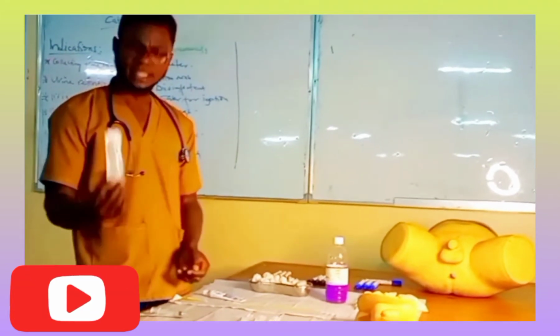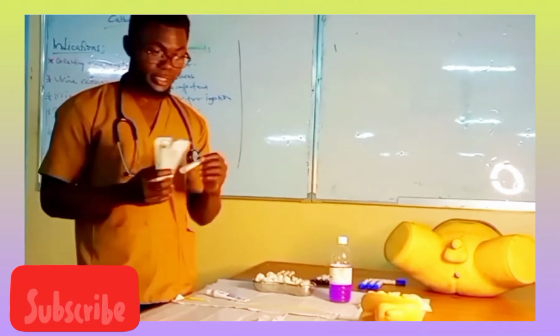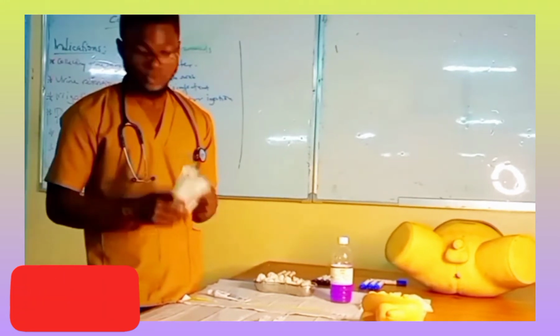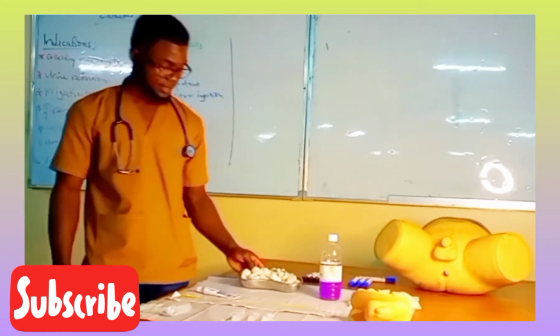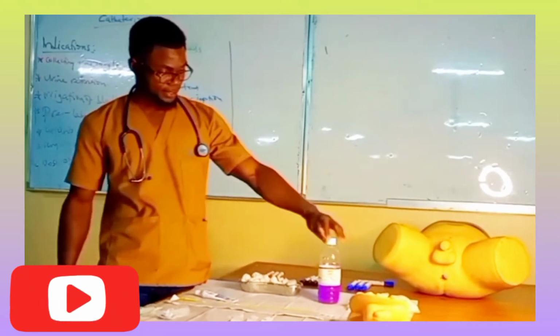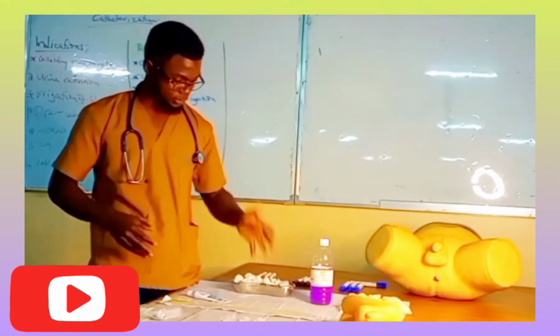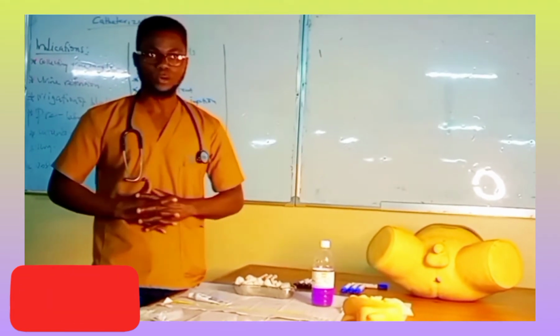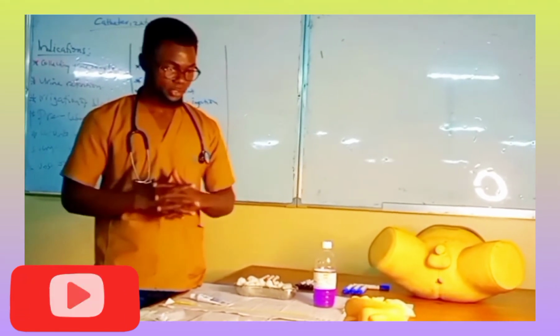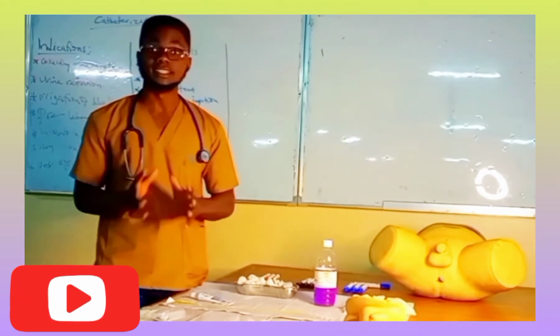So we have syringes, and these syringes are accompanied with sterile water for injection. We use them for ballooning; I'm going to show how we do it. Then I have my cotton swabs for disinfecting, and a disinfectant, which is methylated spirit, used in conjunction with the cotton swabs. I have my gloves and my mannequin model for illustration purposes. So these are the requirements I'm going to be using in this session.